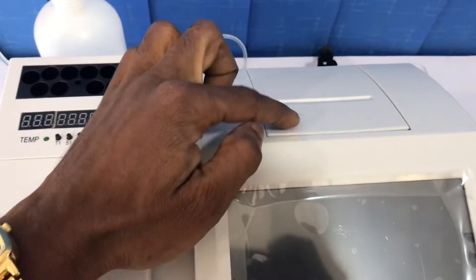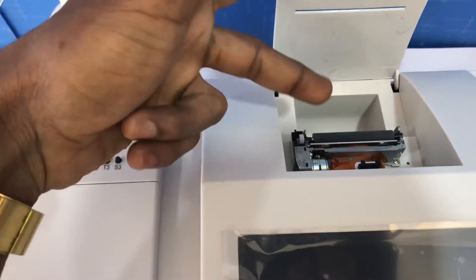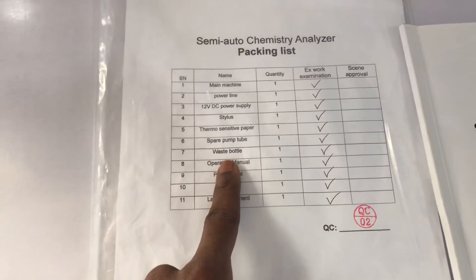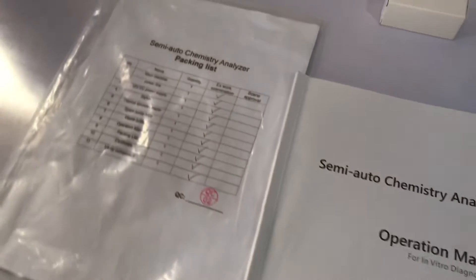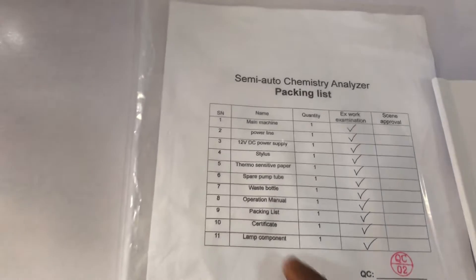Then you have a stylus and thermosensitive paper. The stylus is here and the thermosensitive paper goes here — mine is finished but if you have some you put it here; it's basically for the printer. Then you have your spare pump, provided by the manufacturer, and your waste bottle.